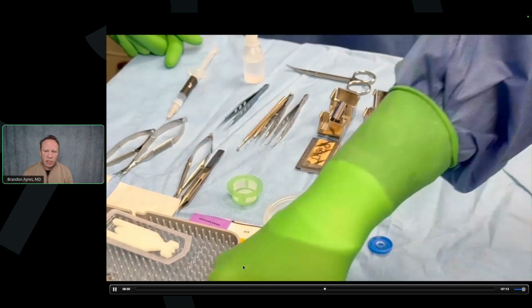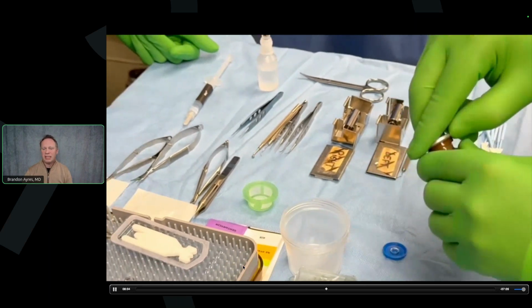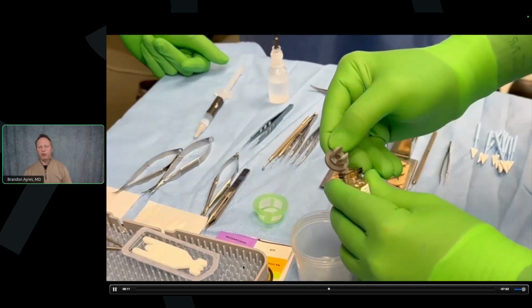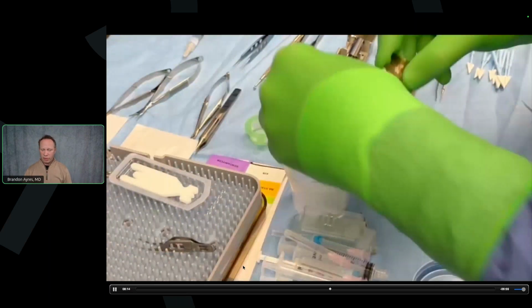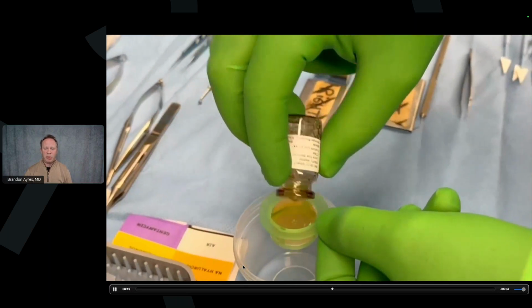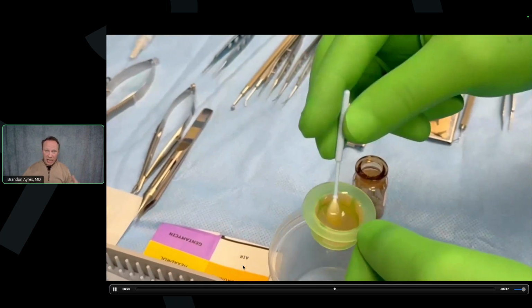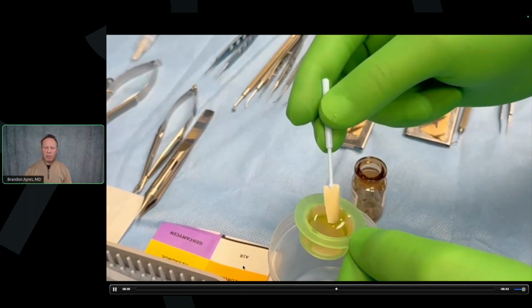This is opening the CTAK segment on the surgical field. And I will say that one of the more challenging things is actually finding the CTAK segment. It's packed in albumin. That little green thing on the surgical field is a strainer. We don't let, and I was just doing this with one of our fellows the other day, you don't throw anything away until you find the segment. I've had it stuck to my finger. I've had it stuck to the cap, but you need to find it. And once you find it, then you can get rid of the cap or the bottle if you want to.